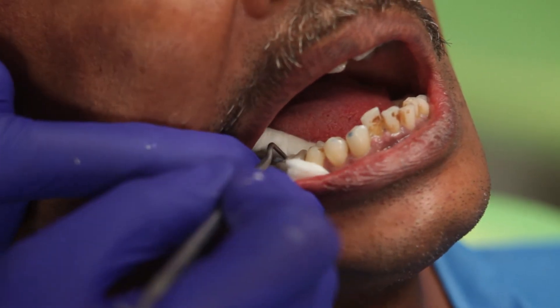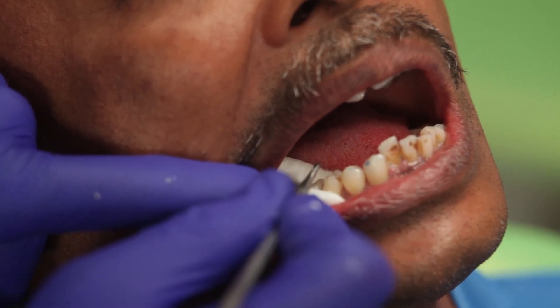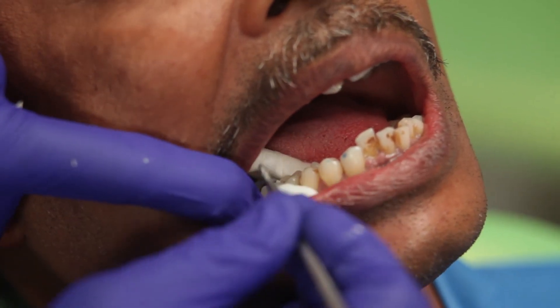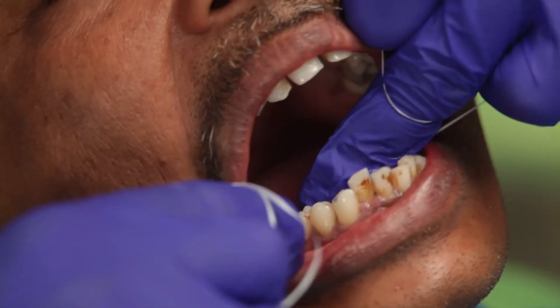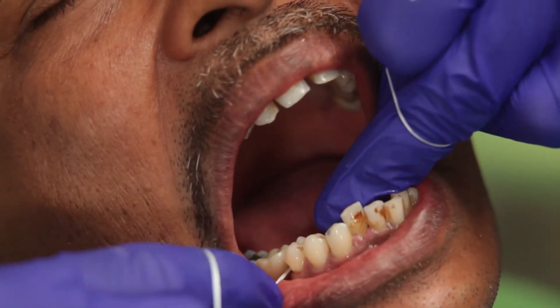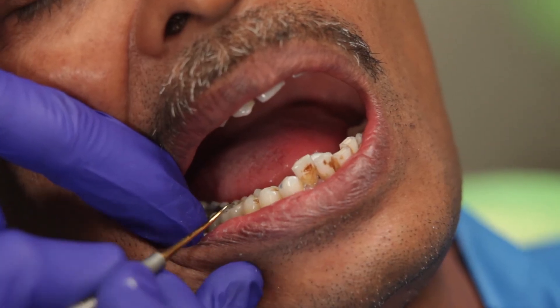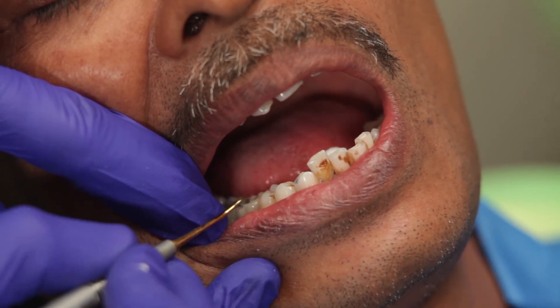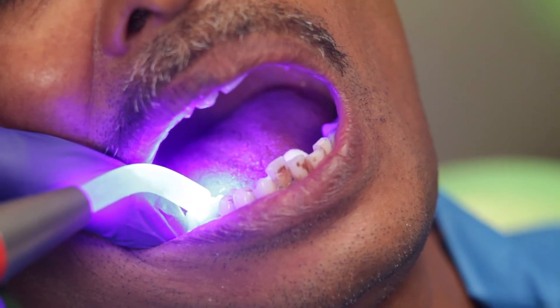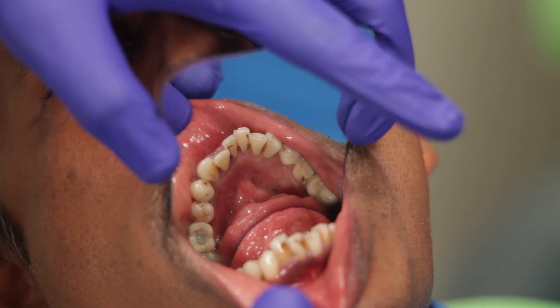Once the cement reaches the semi-solid stage, I can easily go ahead and remove all the excess. The final step is to block out the access hole on the crown with some composite. There it is — our crown has now been cemented onto the abutment.